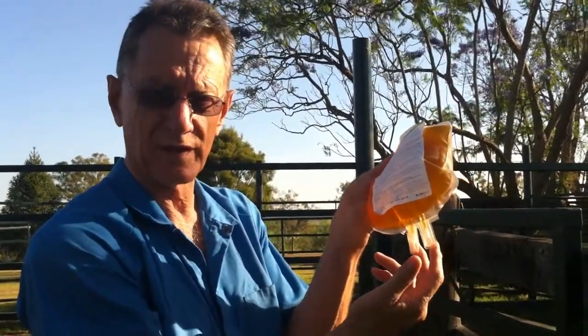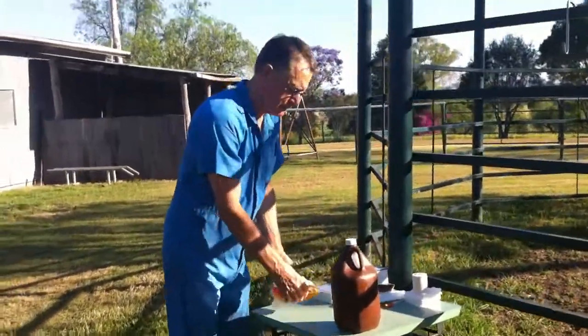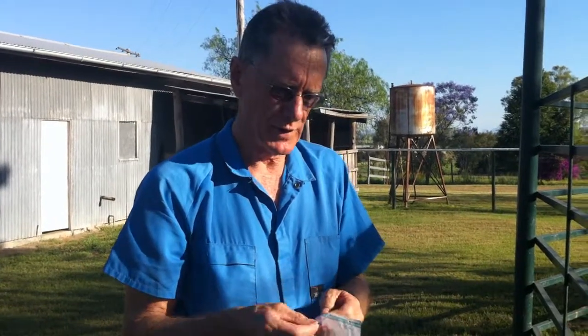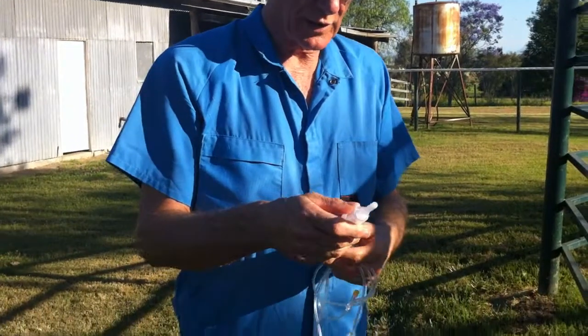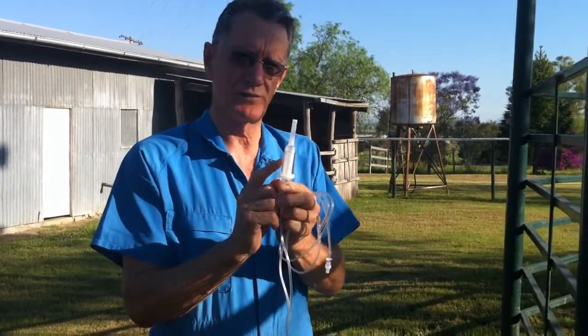These are the two sterile transfusion ports. We'll use one of those to spike the giving set so that we can do the transfusion. What we need first is a giving set — we use the Sangerfix ES giving set. It's got to be technically a blood giving set. This means that it has a filter, 200 microns, 200 micron pore size in it. Because any plasma that's been frozen and thawed again is going to have microparticles, at least microparticles — they might even be visible particles of fibrin in it. And you need to filter them out with this filter. It's very important. Thawed frozen plasma must never be transfused without a giving set that contains a filter.